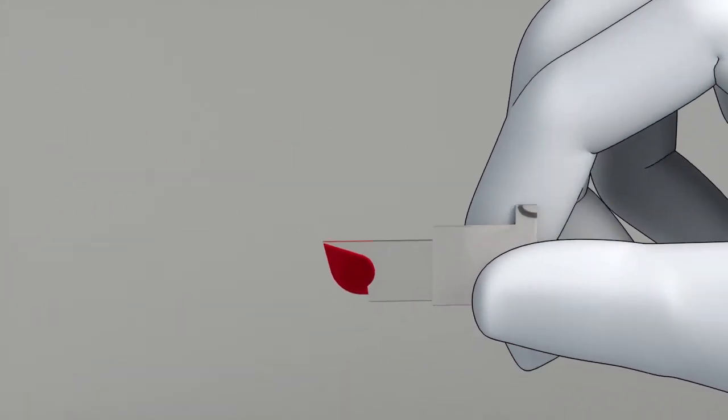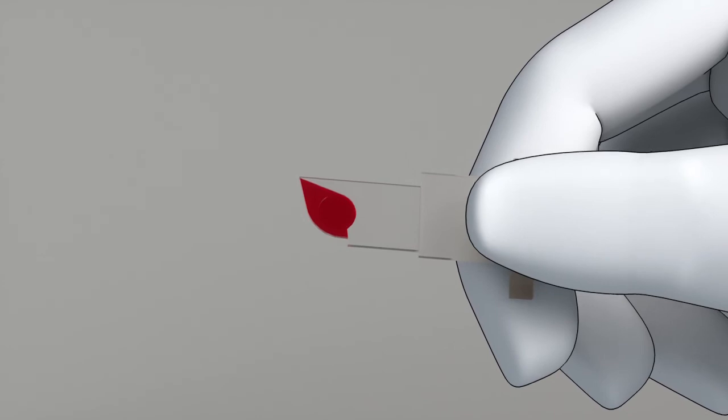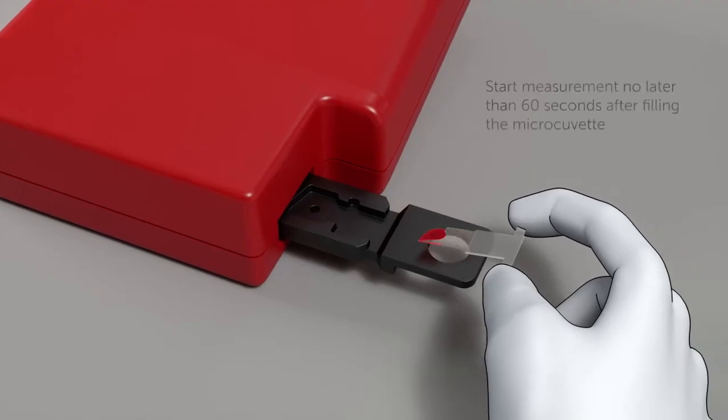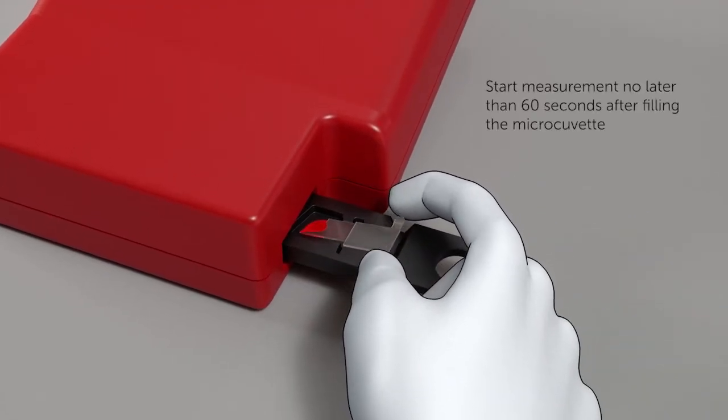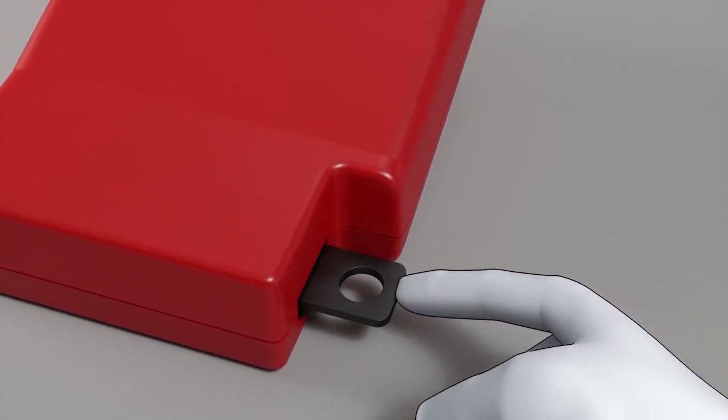Make a visual inspection of the micro-cuvette. If there are bubbles or if the cuvette is not completely filled with sample, discard and fill a new micro-cuvette. Place the micro-cuvette in the cuvette holder and start measurement by gently pushing the cuvette holder to its measuring position.